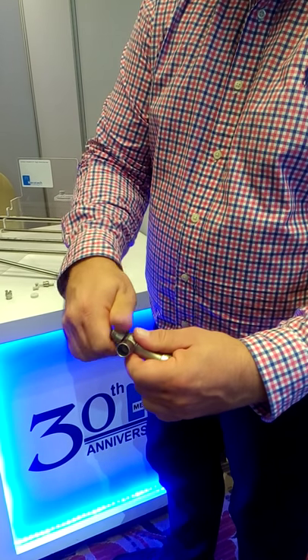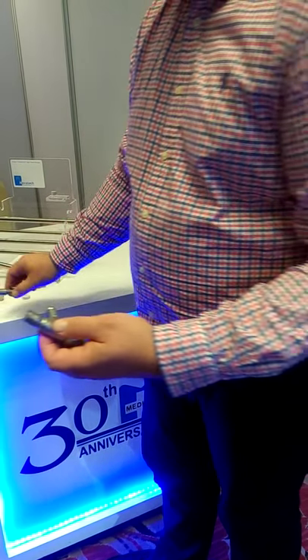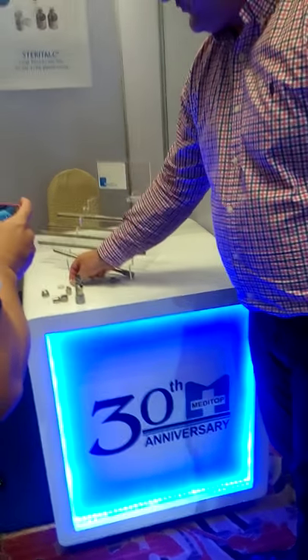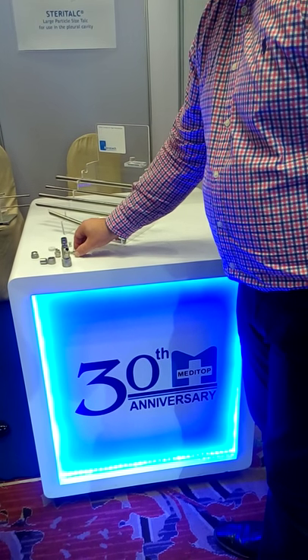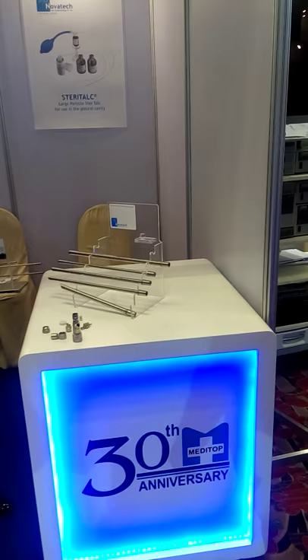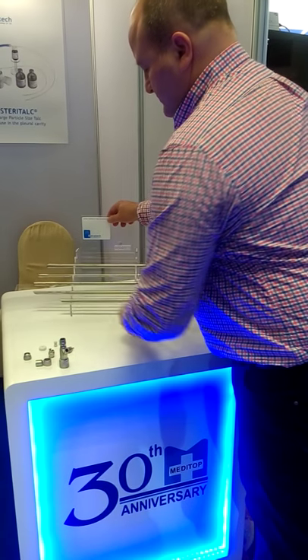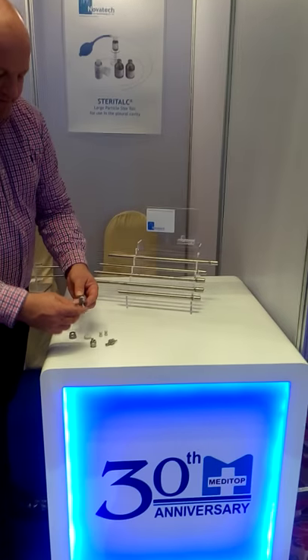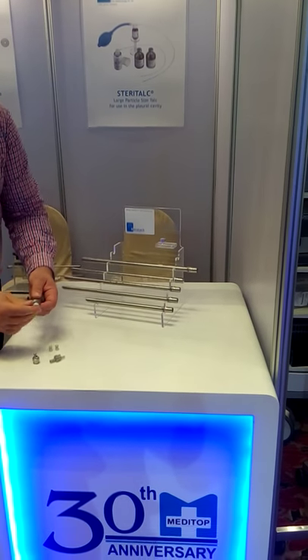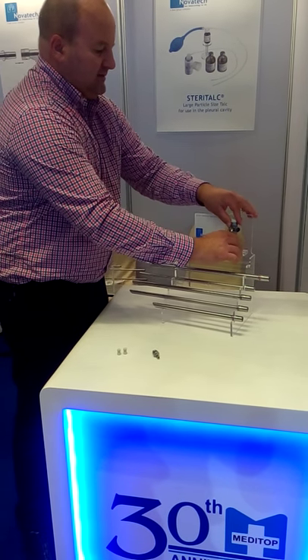You can dismantle it very easily for sterilization and cleaning. You screw off this cap here, then you take off this part, and separately you have this one. All these items can be easily sterilized for future use. Next I will show you how to place a stent using the bronchoscope — first I will reassemble it, put the cap on, and put the double port on the back.